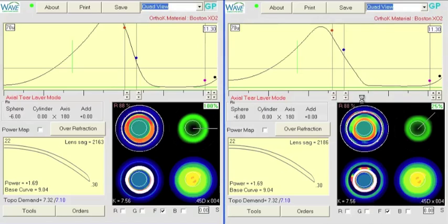And sometimes this gets a little bit tricky. It's kind of trial and error until you find something that works. And these are not working that well. Okay, that looks a little bit more regular. And then I'm going to bring down the periphery of the lens.